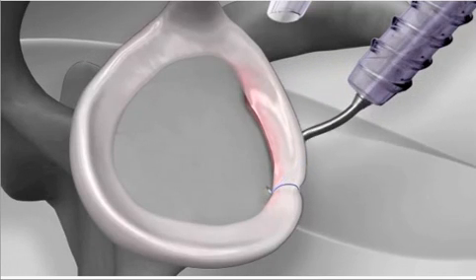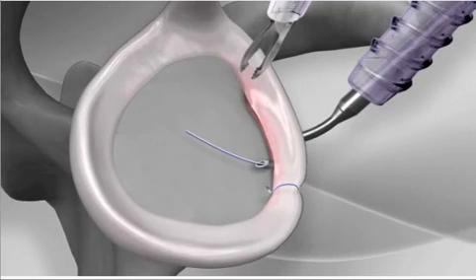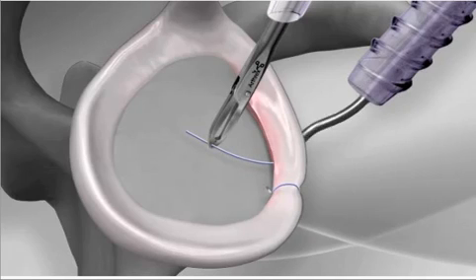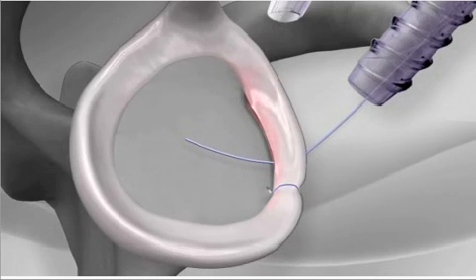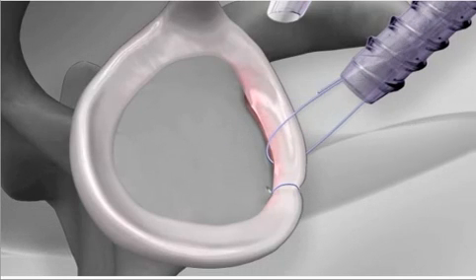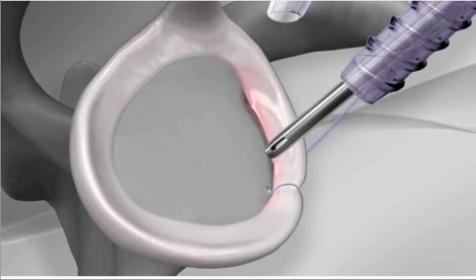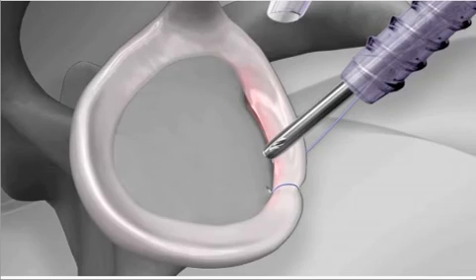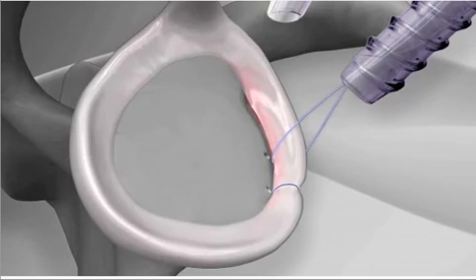Alternatively, the looped wire can be eliminated, and the suture passed directly underneath the labrum. It is fed into the joint and the end is retrieved with a grasping instrument. Another socket is drilled and the suture is fed through the push-lock anchor and hammered into place.